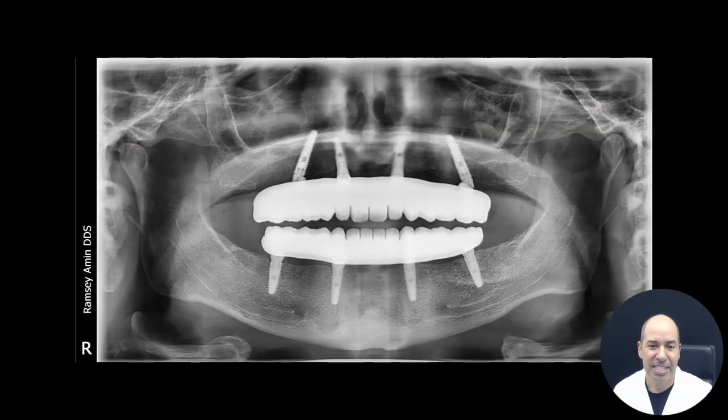And you can see, the finals. The zirconia is always going to look like this. If your bridge does not look all white like that, you don't have all zirconia. You have some modification of plastic or overlay or something over this. I like just straight zirconia. It's very strong and it doesn't break easily at all. So, right into the eyes, very, very nice aesthetics. Very nice aesthetics from the side views.